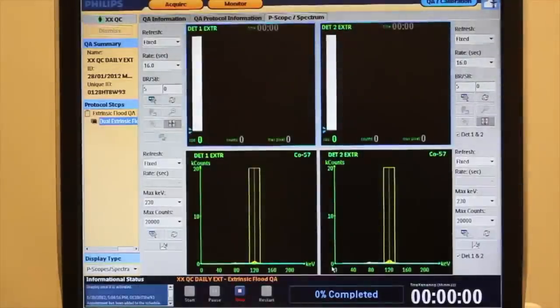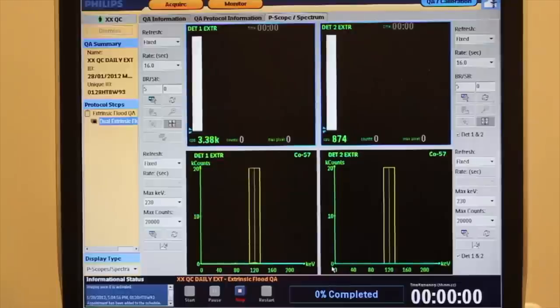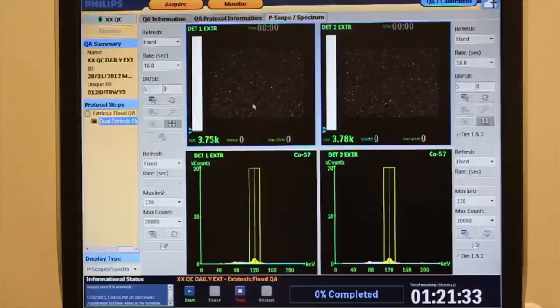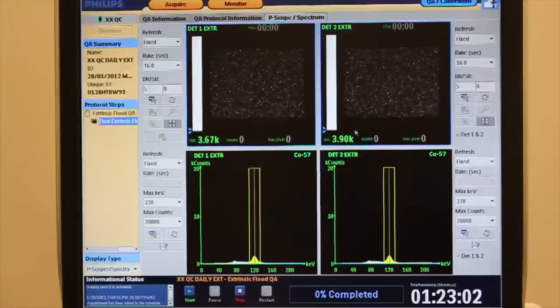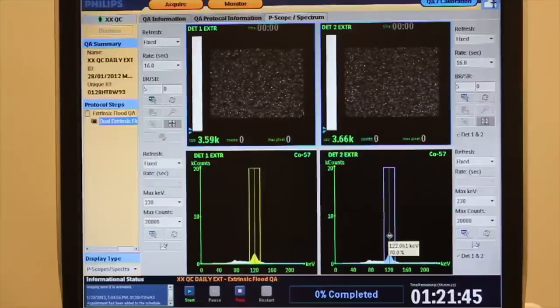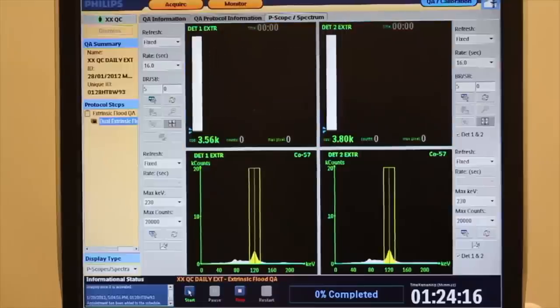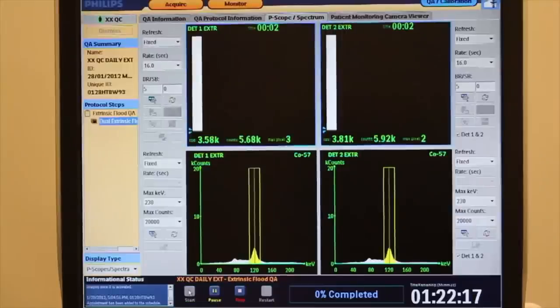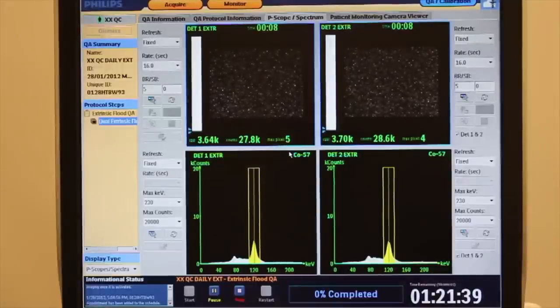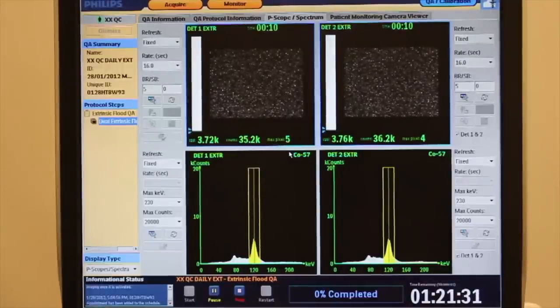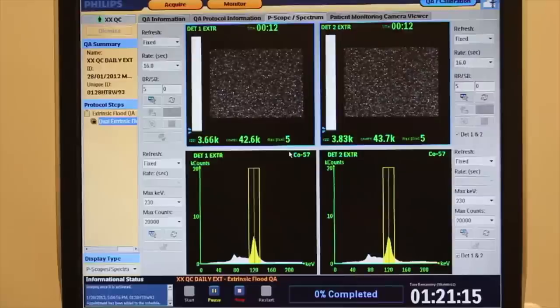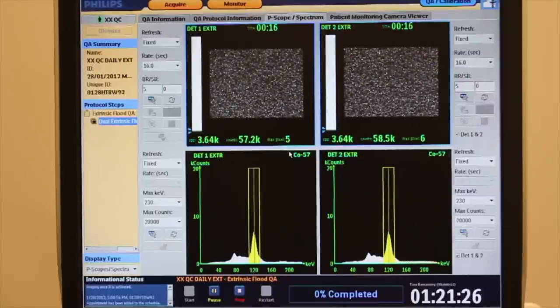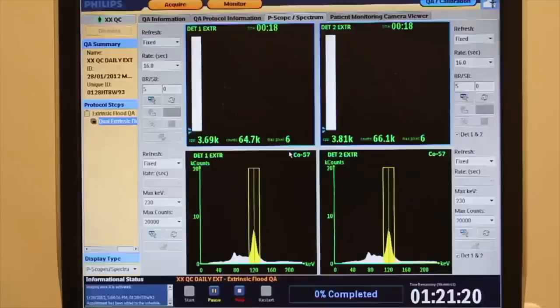Proceed into the P-scope and preparation of the acquisition. Confirm that the count rates are within acceptable limits and start the acquisition. Note the progress slider and confirm that the acquisition is in progress.